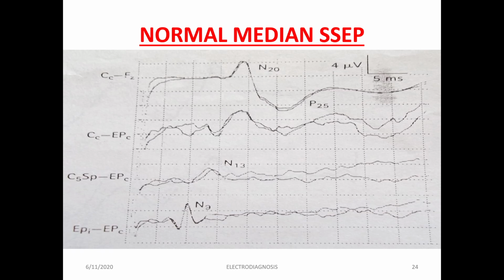So here you can see this is the sweep speed. That is kept at 5 millisecond. 5 millisecond means 1 centimeter in the graph.